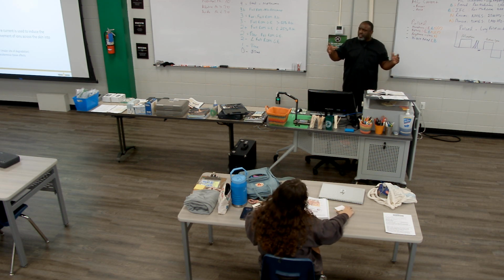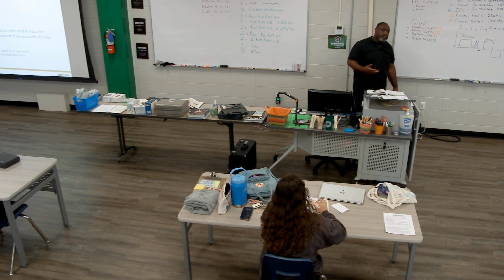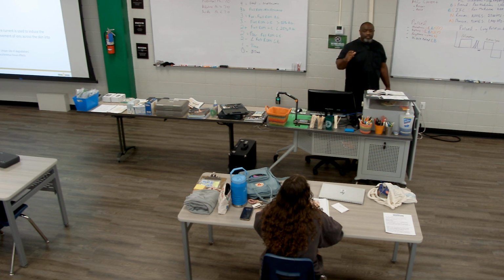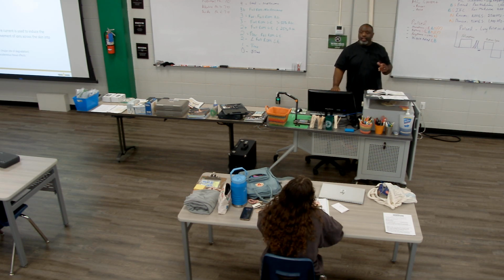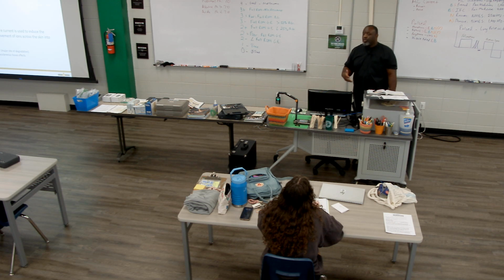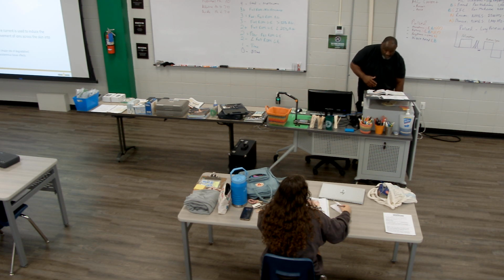Did y'all do that with Ms. John? Talked about it a little bit? Yeah, so it is something that's not done as much clinically as well. But phonophoresis is they'll take the medication and mix it in with the ultrasound gel, and you'll phonophorese or ultrasound it into the body. And it helps to use that waveform to help pulse it into the body. So instead of us using ultrasound, we're going to use E-stim to help get medication into the body. So we're using E-stim to help push medication into the body.